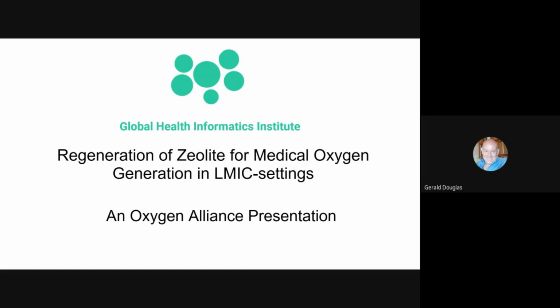Our target would be to say, if you were not regenerating and you had to buy zeolite over that period of 3 years, how much money would you spend on zeolite versus if you bought this piece of equipment and you were regenerating, even after you've paid off the cost of the equipment, it should still be a net positive gain. So it should be cheaper to regenerate than it should be to continue to buy zeolite.